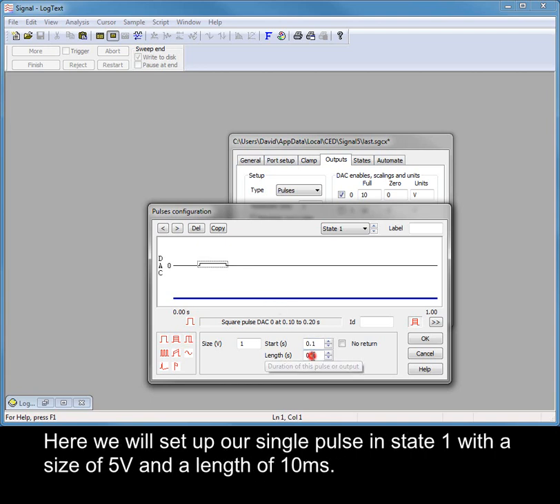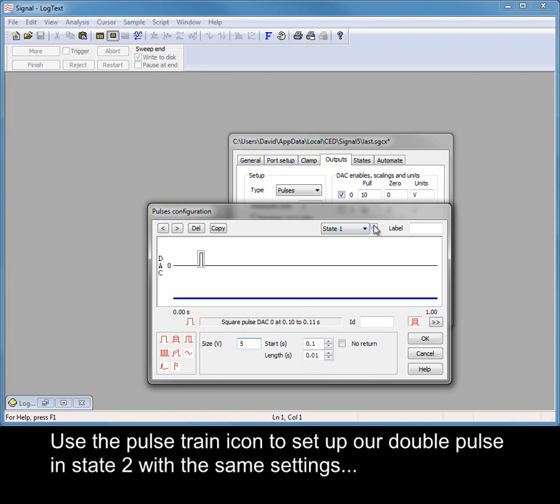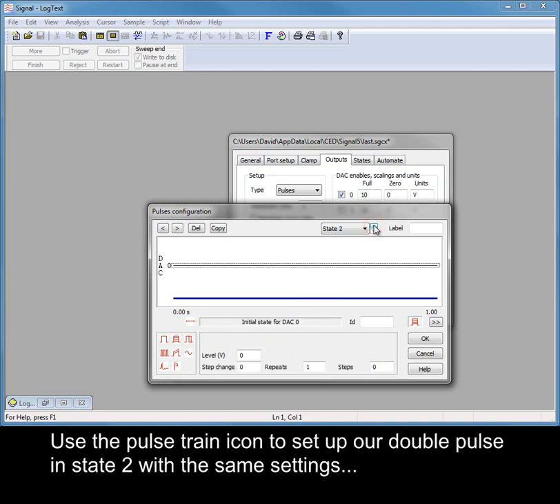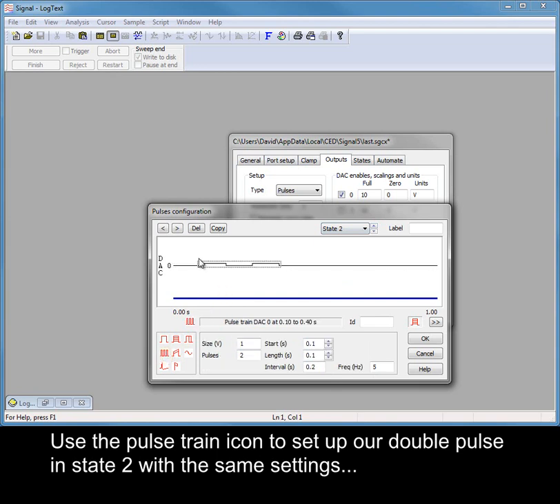Here we will set up our single pulse in state 1 with a size of 5 volts and a length of 10 milliseconds. Use the pulse train icon to set up our double pulse in state 2 with the same settings.